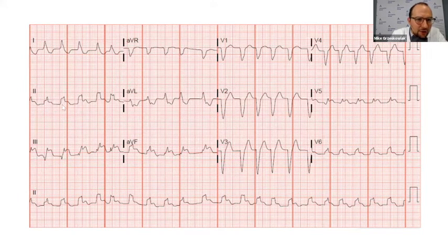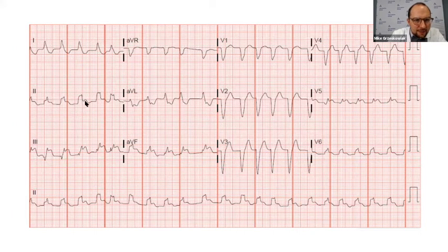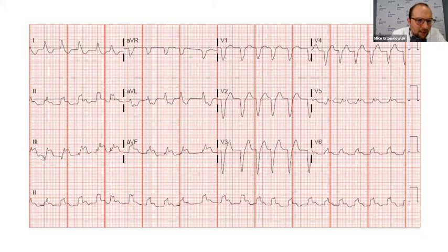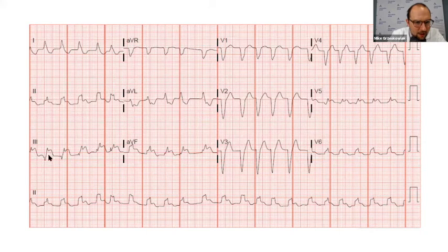Looking at lead two, this just looks kind of wonky in general — it's just kind of waving up and down. You don't really see the QRS complex clearly, maybe a T-wave there, maybe some kind of ST elevation. Then moving to the next lead, we clearly see an ST elevation. Here's the baseline, here's the QRS complex, here's the T-wave — a clear four, maybe five millimeter ST elevation.